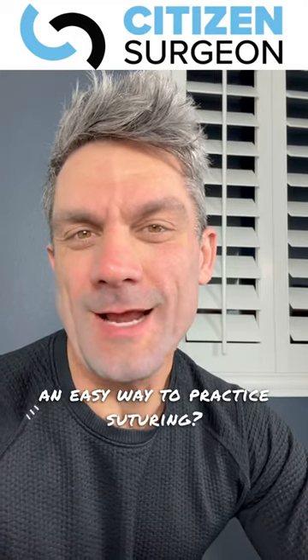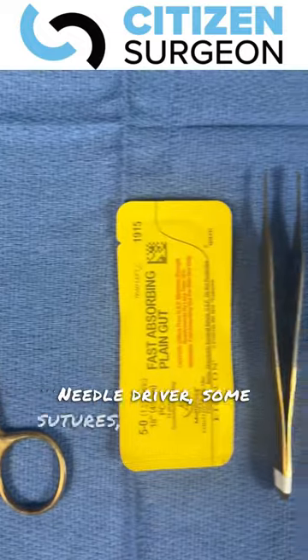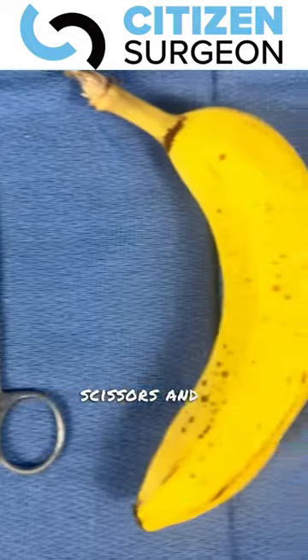Want an easy way to practice suturing? I'm going to show you right now. You only need a few things: needle driver, some sutures, some forceps, scissors, and of course the banana.